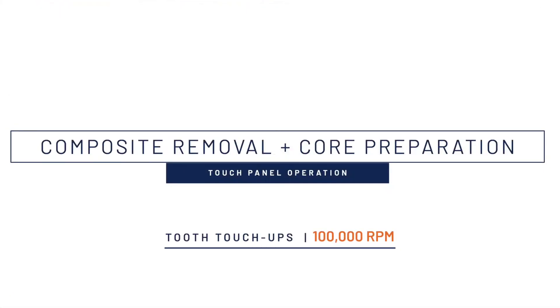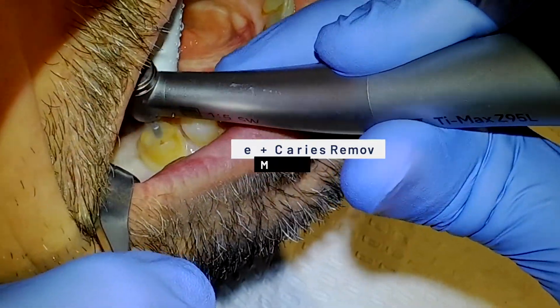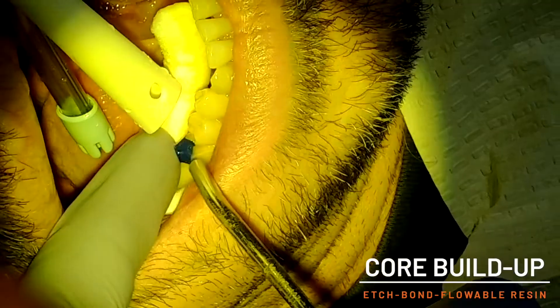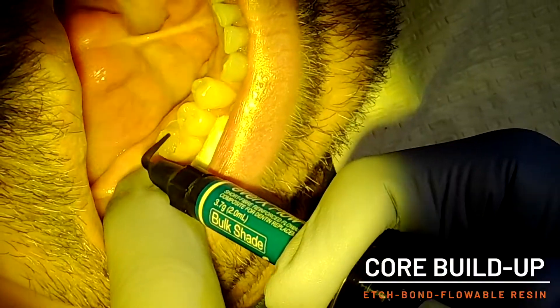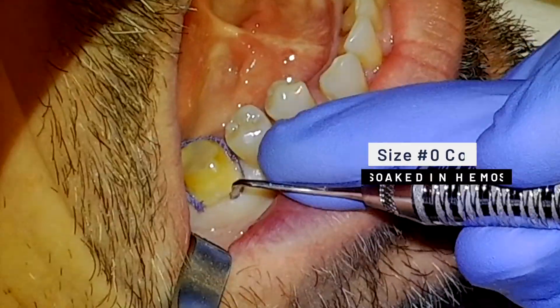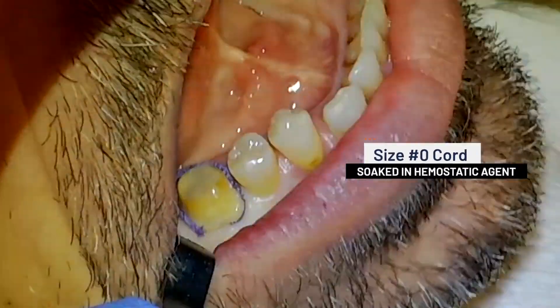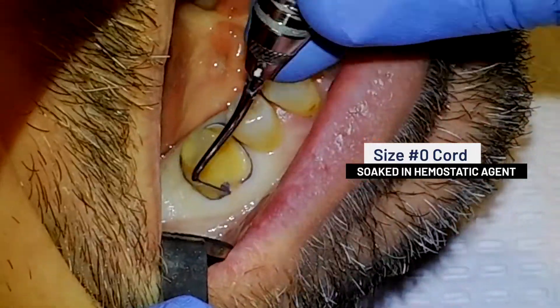After the tooth has been prepared to the ideal form, the existing restorative material and recurrent decay is removed in preparation for the core buildup. Phosphoric acid etch, bonding agent, and placement of a fiber-reinforced flowable resin are completed. Cord placement on molars is less about hiding the restorative margin, and more about gaining additional height of the tooth preparation.